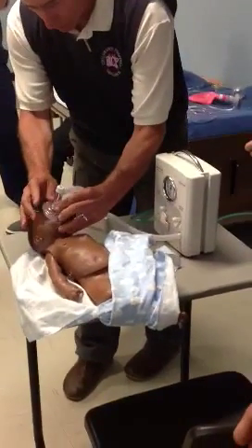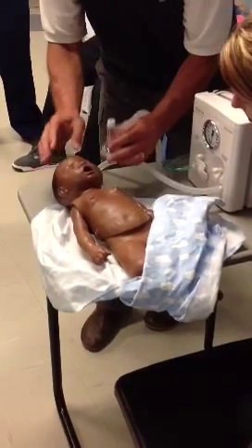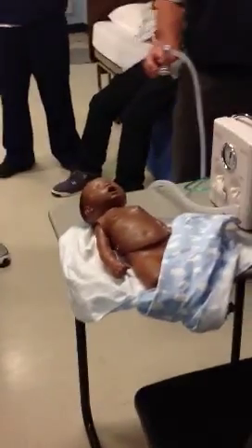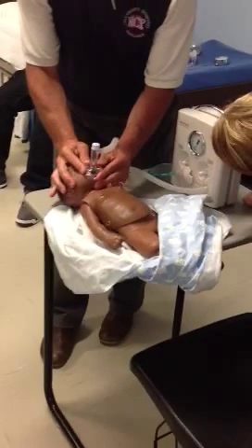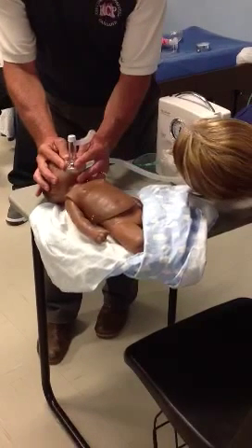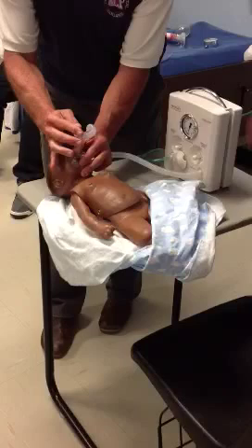I'm holding it down now. I'm giving about five of CPAP right now. If I want to give more CPAP, what do I do? I simply close this valve right here.